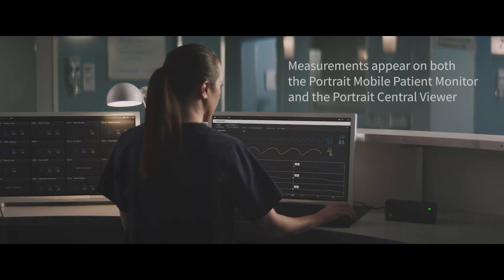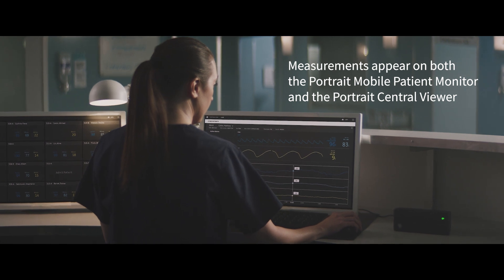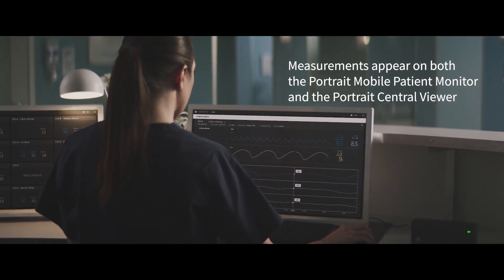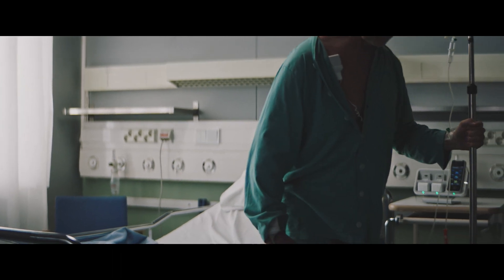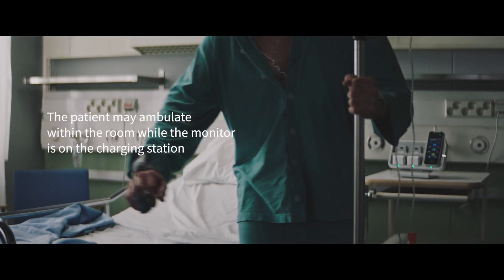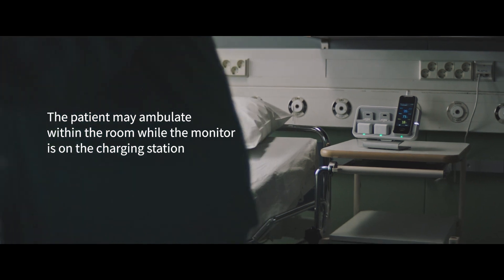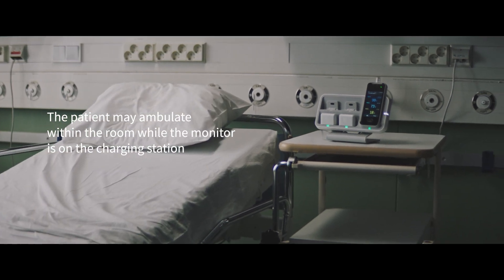A patient could also be monitored with a single sensor. The measurements automatically appear on both the patient monitor and the Portrait Central Viewer. When walking within the room or going to the restroom, the Portrait Mobile patient monitor can stay on the bedside charger and continue to monitor the patient.